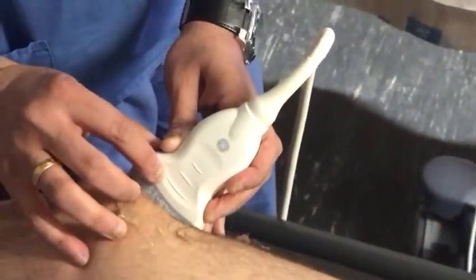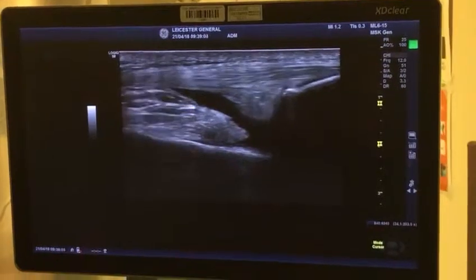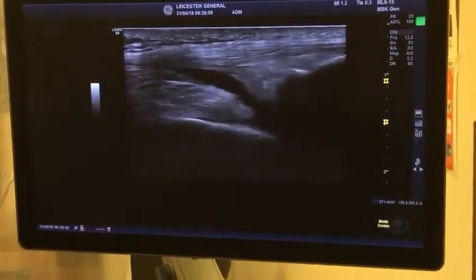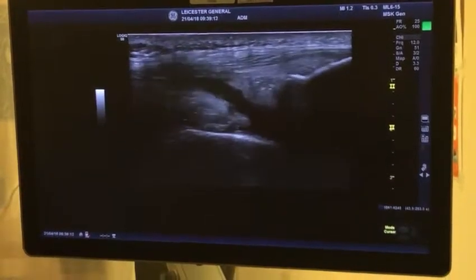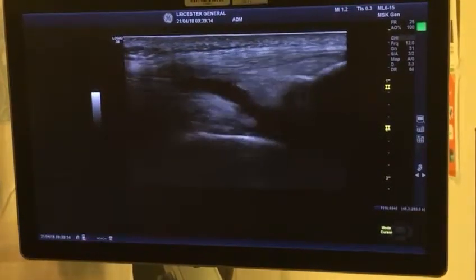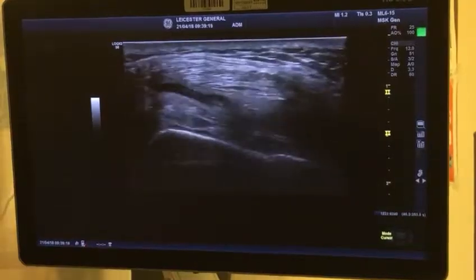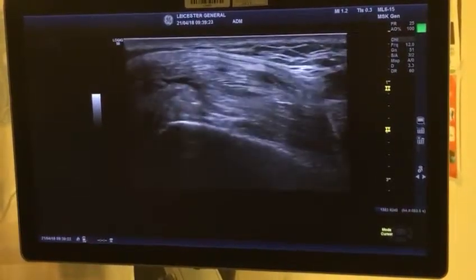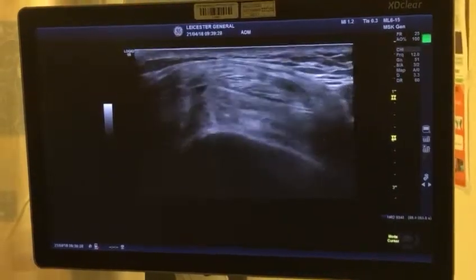The way to do this injection: if I move the top edge of the probe a bit more lateral, I've gone out of the quadricep tendon and can use the in-plane technique, bringing the needle in from proximal to distal. The other way is to keep that black shadow in view so you can still see the suprapatellar recess.